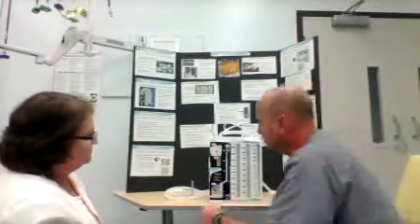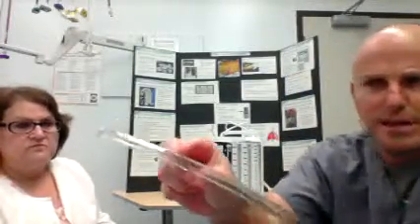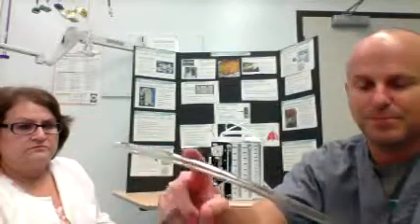So then, assisting the provider, once you put your water in and you have your closed drainage device ready to go, really all you're doing is waiting for the provider to insert the chest tube. This is what a chest tube looks like. That's going to go in the patient. This is the part that goes into the patient. And if you notice, there are holes in different areas completely around the circumference of the tubing. And that's to collect the most drainage possible.